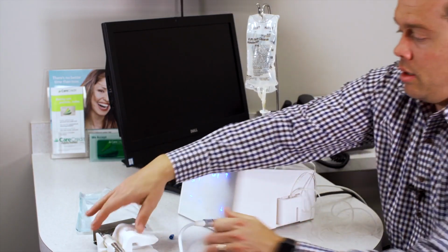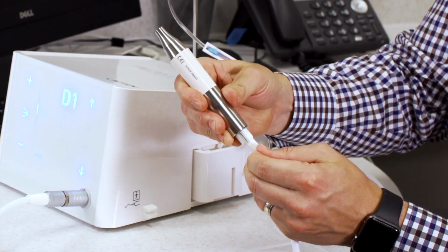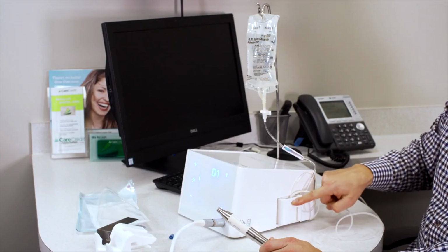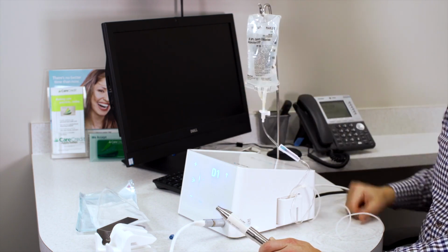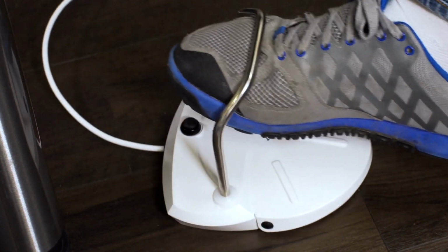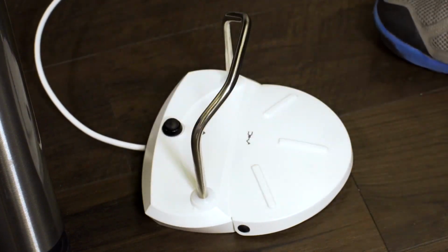And then you have your other end that plugs into the handpiece. So you've got your tip that plugs into the handpiece, you've got your coil that runs through the motor, and then you've got your tubing and your plunger that runs into your saline bag here. The foot control has a nice little handle that you can pick up and move around for ease of movement.